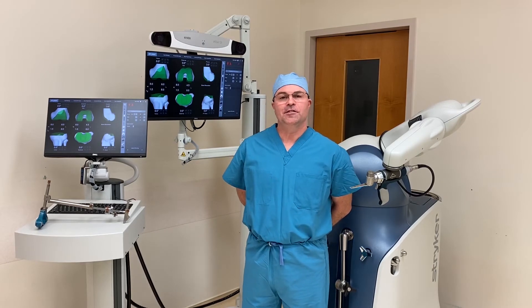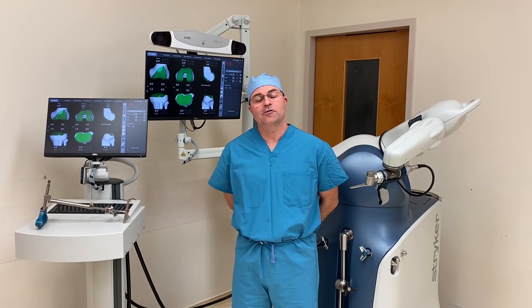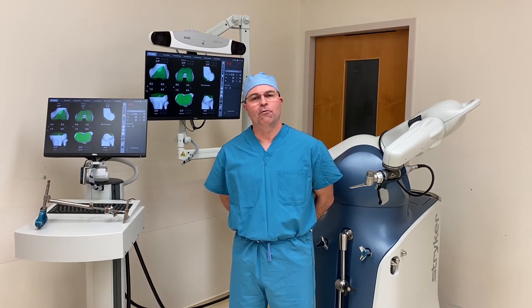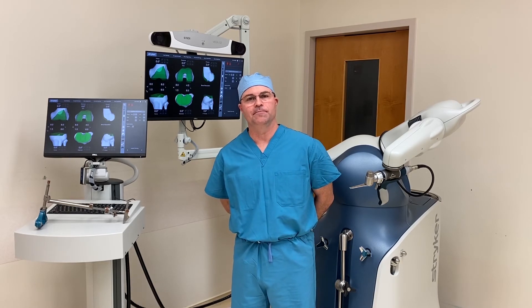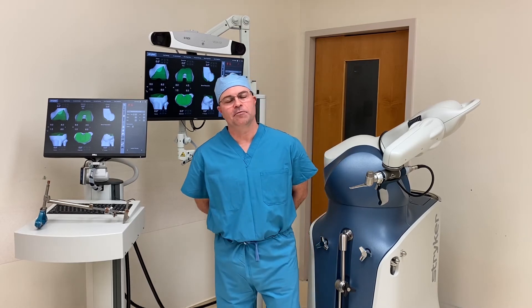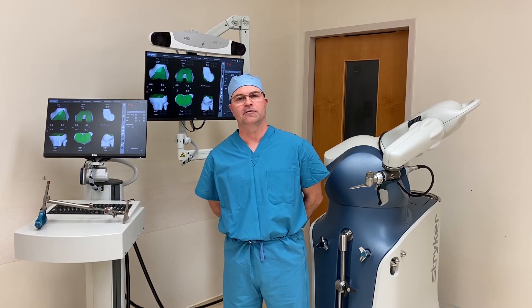The robot uses patient-specific information based on a preoperative CT scan that allows me to fine-tune the knee replacement both before and during surgery in a way that's simply not possible using standard instrumentation. The robot makes a CT-based bone model that allows me to size the implant as well as to align and position the implant for ideal mechanical alignment.